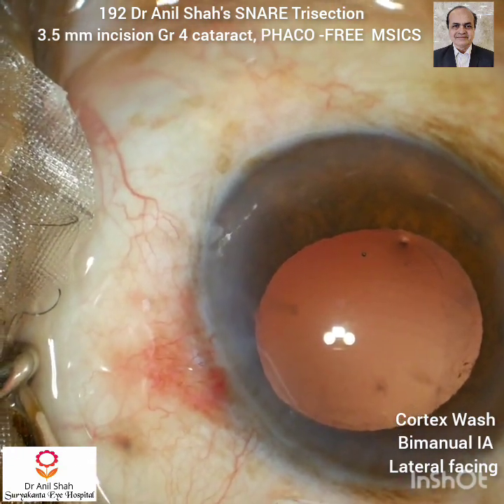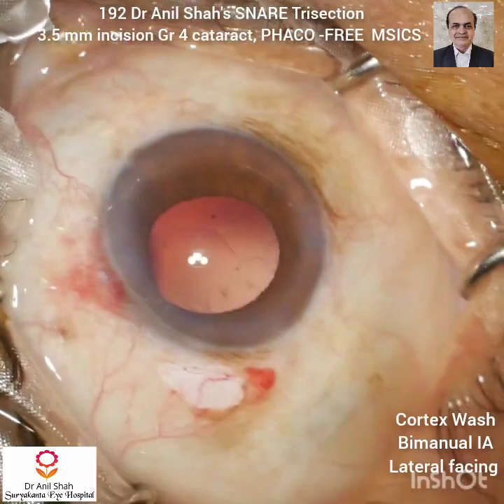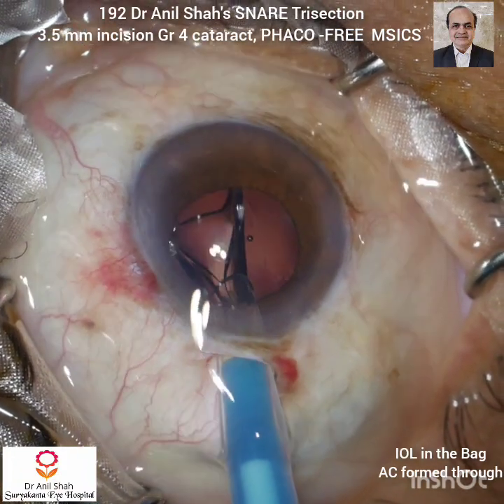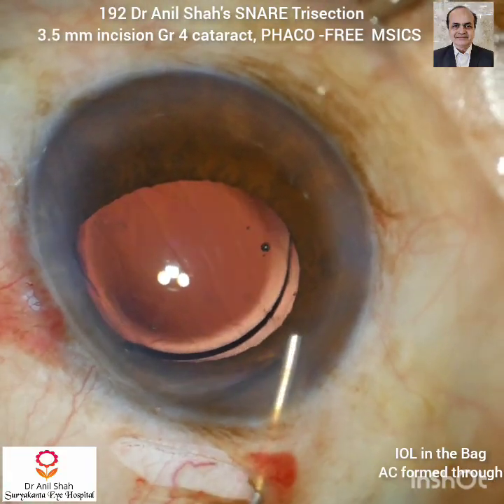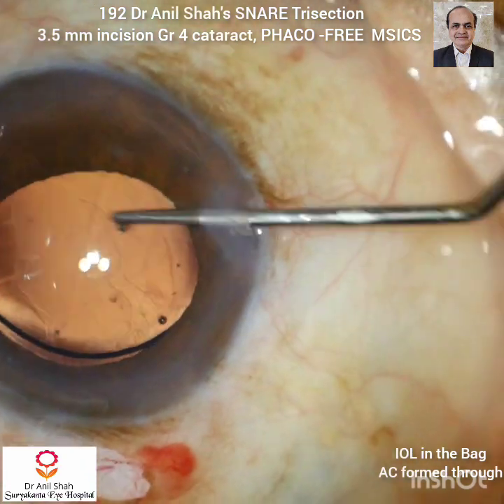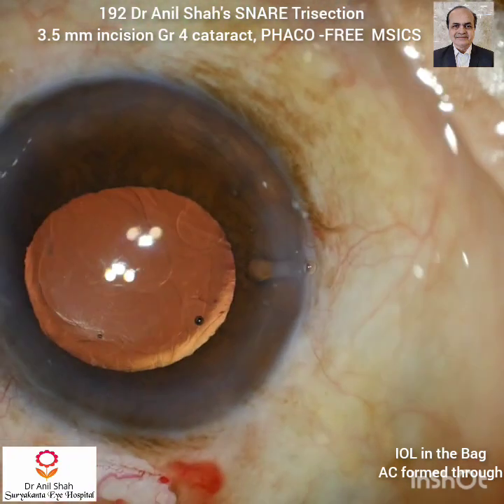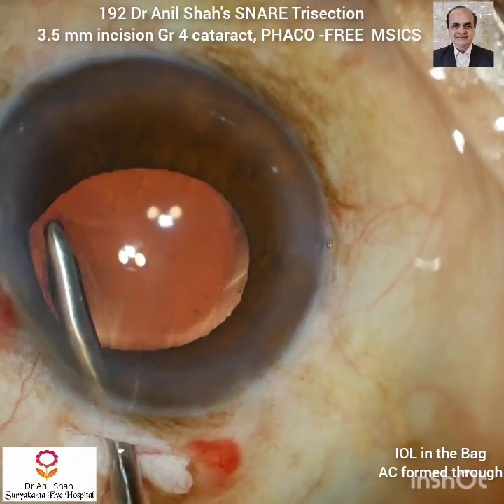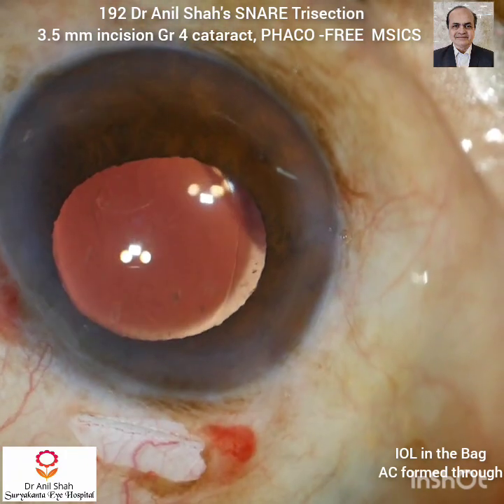Now after this I fill the anterior chamber with HPMC and sodium hyaluronate. This is a hydrophobic preloaded IOL which goes smoothly into the anterior chamber. Then with the lens dialer I will pass this haptic into the bag. Thorough washing of the HPMC and OVD is done with the bimanual irrigation.